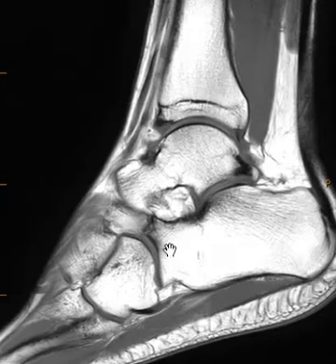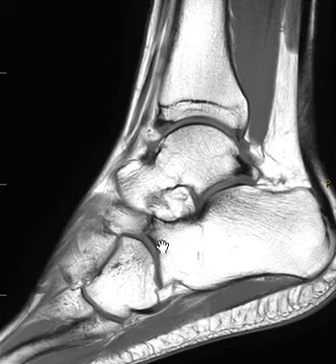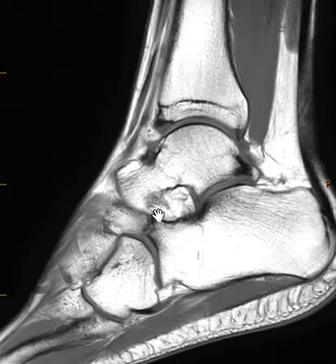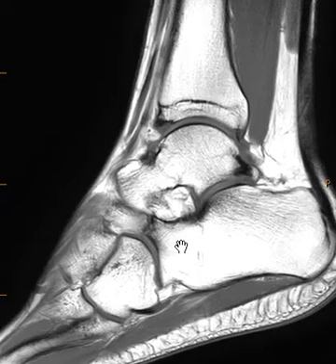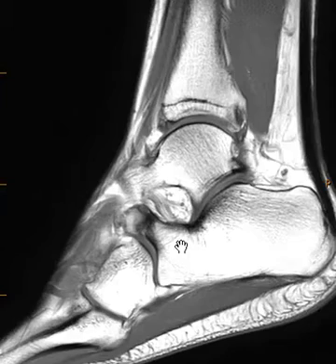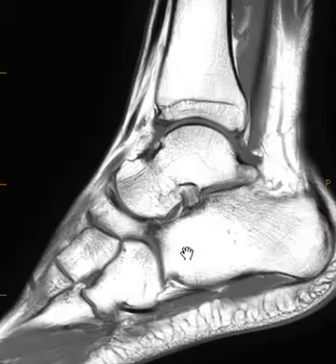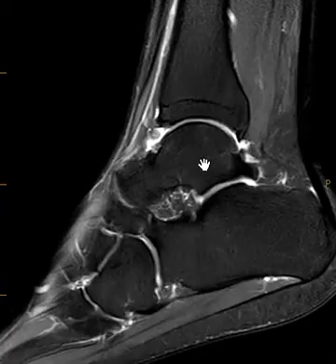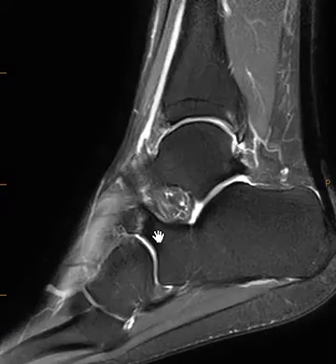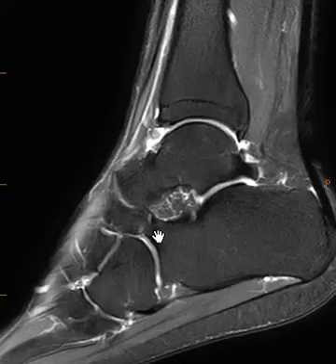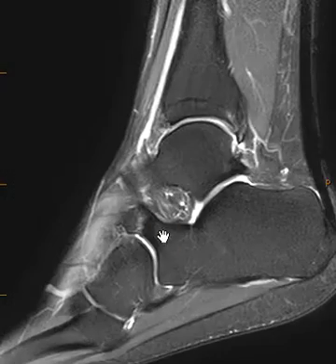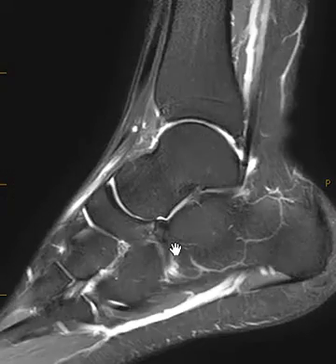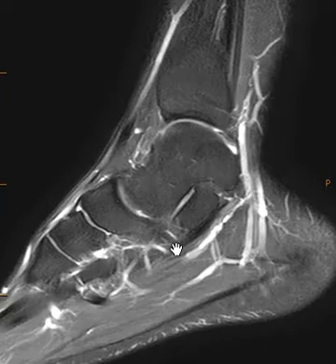For this patient, it's hard to tell if it's a fibrous or cartilaginous — there are some elements of both — so we call it fibrocartilaginous to keep it easy. This patient has a fibrocartilaginous coalition. We look to see if they have marrow edema associated with it, and they really don't have much marrow edema. So it's just a broad fibrocartilaginous coalition with no reactive marrow edema, but it looks like this is the cause of their pain because everything else looks very good.